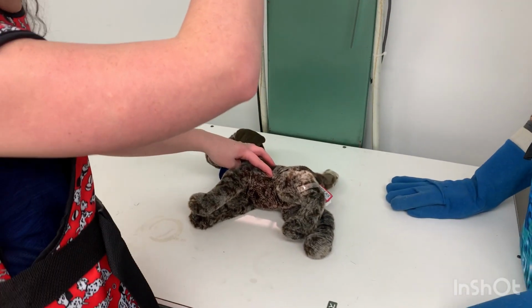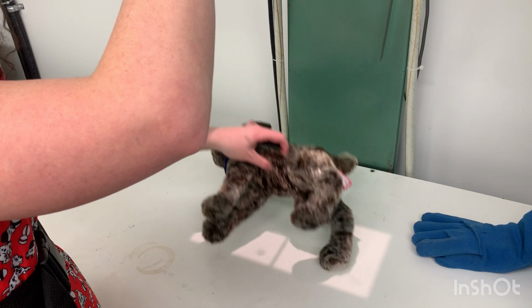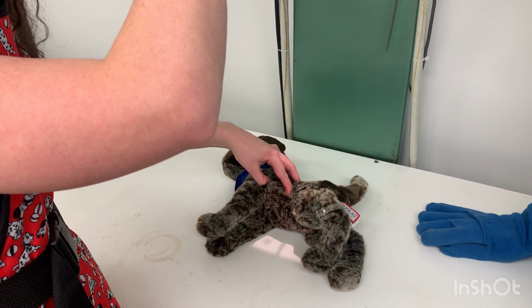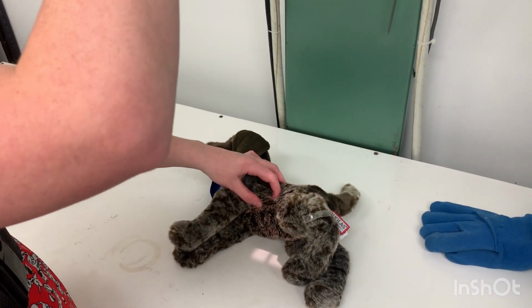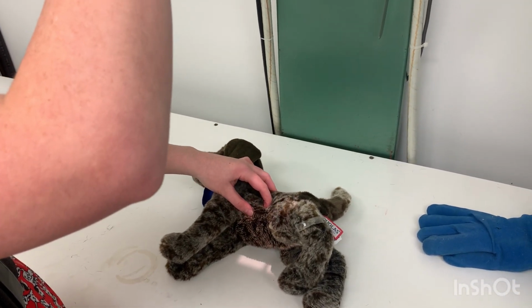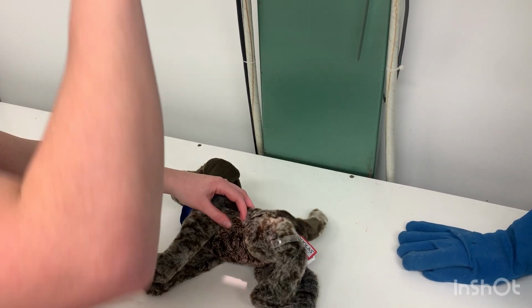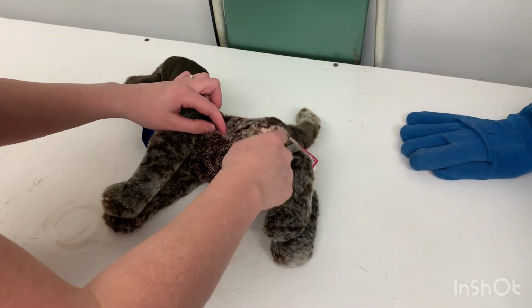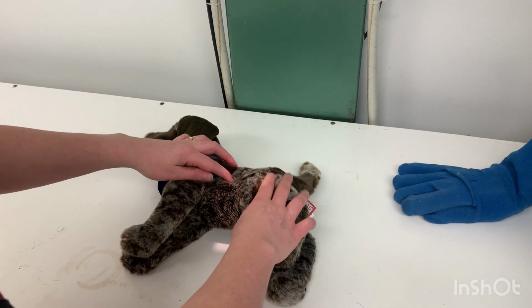So this is how you would adjust your collimation. Now, it will only go, as you can see here, it will only go so small. So that's about as small as I can get it to go. Or no, it will go smaller, sorry, ignore me. But now we can see here, that's where the collimation starts. Collimation is ending right about here. So that's about where we need for the collimation field.